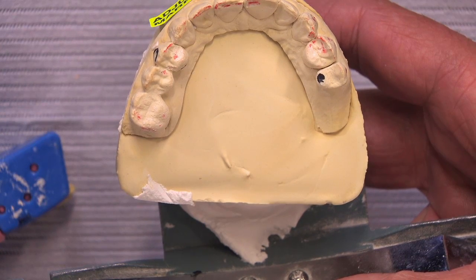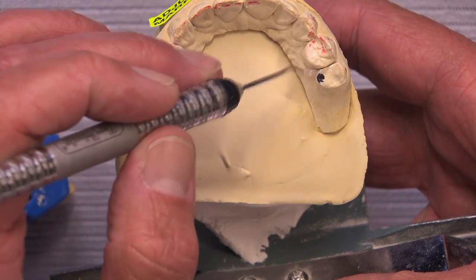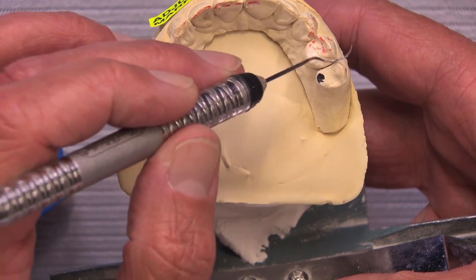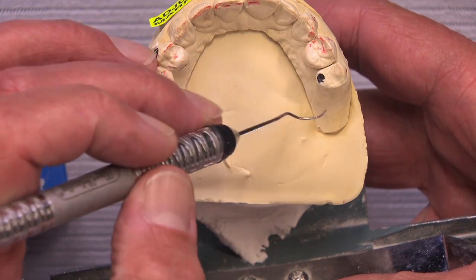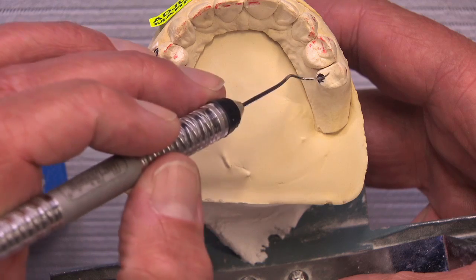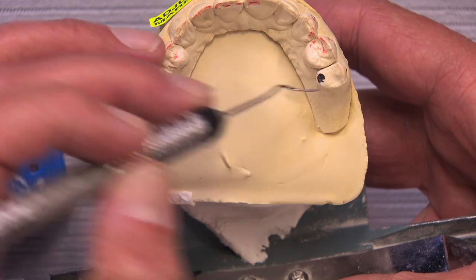We really don't need the use probably of a reduction coping here. It'd be difficult to do because the reduction coping wouldn't fit on here. Reduction copings fit well on preps because the interproximal contacts are broken. Here it wouldn't really go down, wouldn't really fit, but you can just eyeball this and just take a football diamond and spot it a couple times.